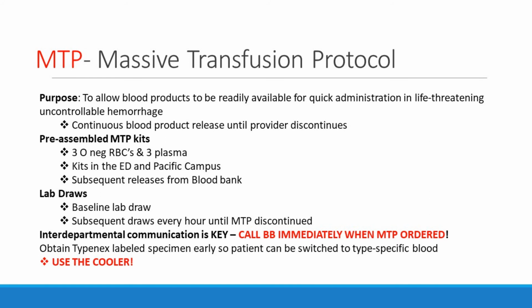And the key here is make sure that you call blood bank right away when one of these is initiated. I'll show you a picture of why in the next slide. And then also make sure anytime you pull those kits out, to put them in the cooler, to use the cooler.